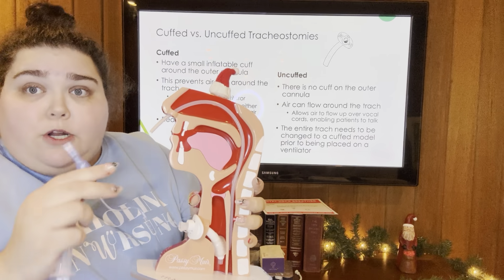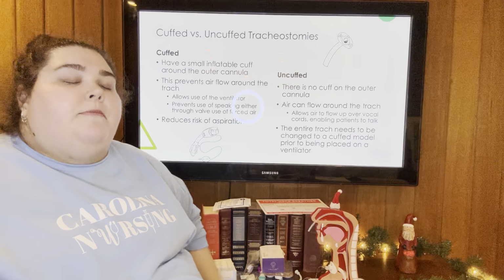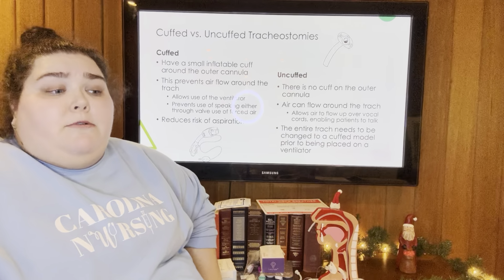The problem with that is because there's no air getting around the tracheostomy, there's no air getting up to his vocal cords. So Tom is not going to be able to speak like this. We want Tom to be able to speak if he's going to have the trach for a long time.